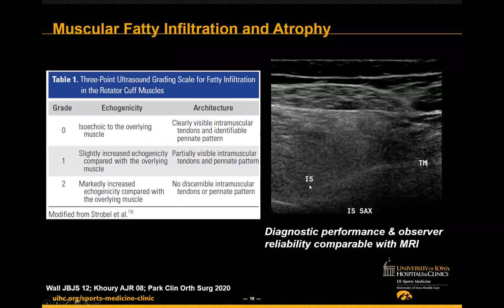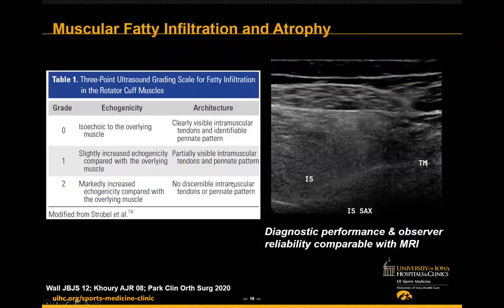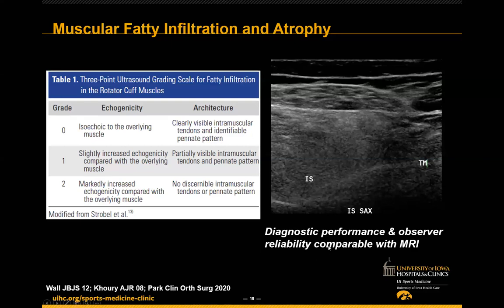The grading scale typically used employs both echogenicity and architecture — simply being able to discern the intramuscular tendon and the pinnate pattern. You can clearly see intramuscular tendon and pinnate pattern in normal muscle; as fatty infiltration occurs the infraspinatus becomes hyperechoic and you start to lose the ability to distinguish that central tendon. Using a grade zero, one, or two provides good information and the literature shows pretty good reliability.